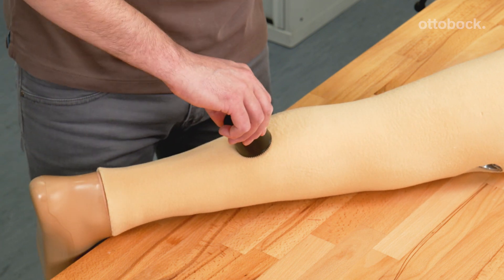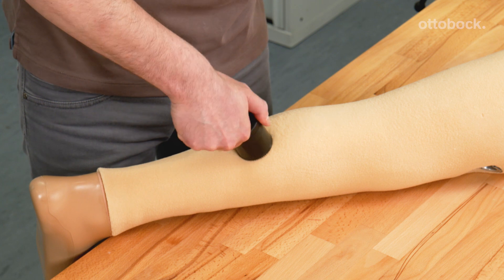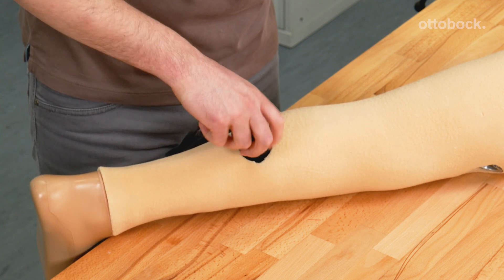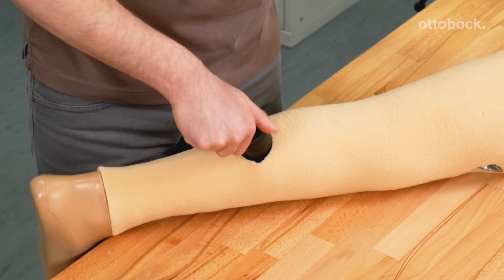Rotate clockwise to cut a hole into the foam cover. Please note: applying too much pressure can rip the foam and lead to an uneven inner surface. Remove the hole cutter, unscrewing the centring rod.